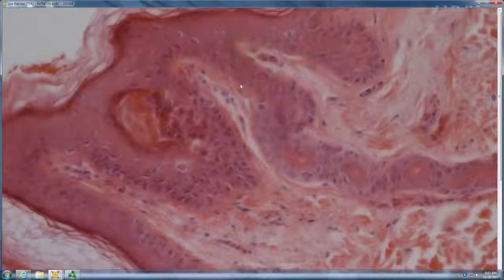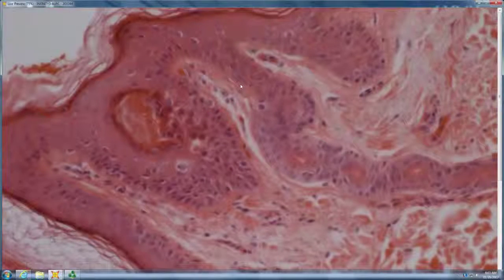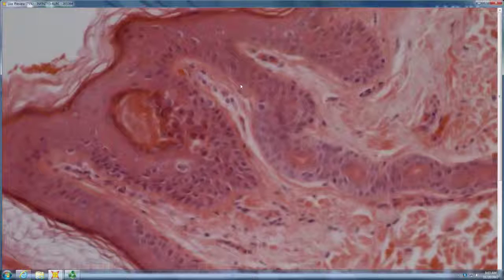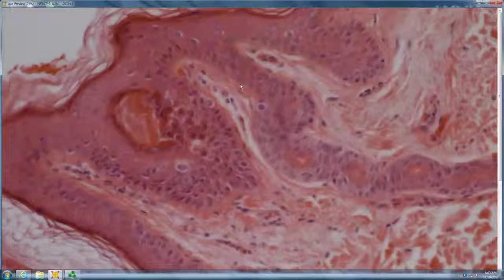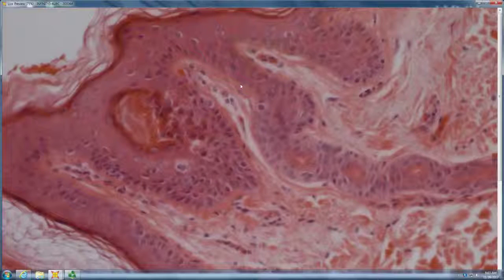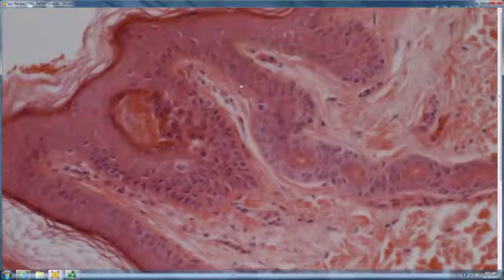So what would give you vacuoles in a granular layer with both blue and red granules? Epidermolytic ichthyosis, where it would be the whole epidermis, or if it's very focal, it's just isolated EHK, epidermolytic hyperkeratosis, which is a common incidental finding, especially associated with atypical nevi. That's really, really common.